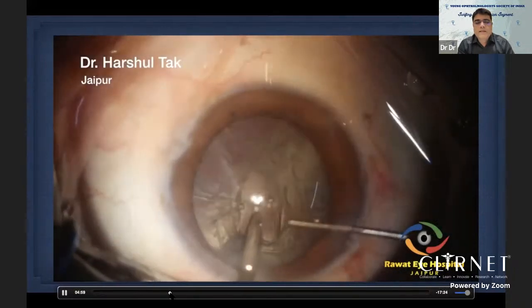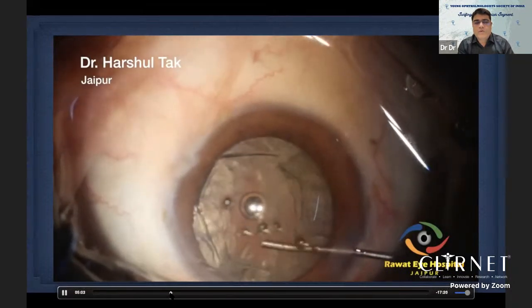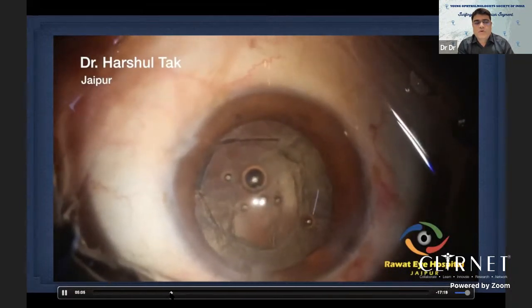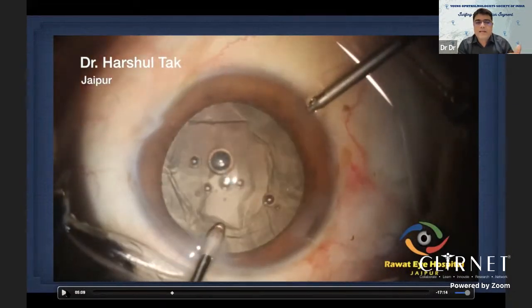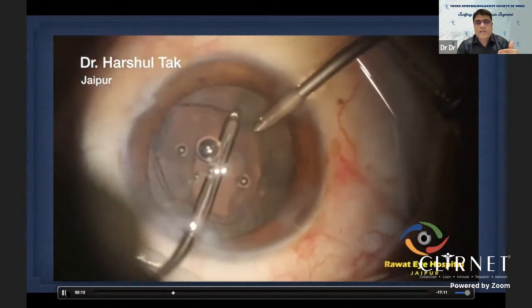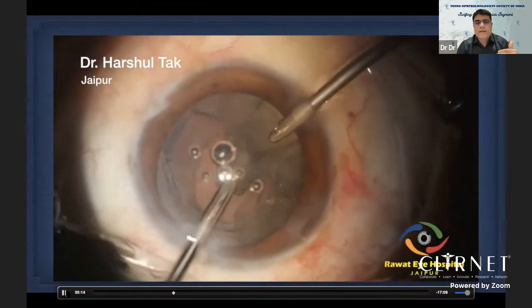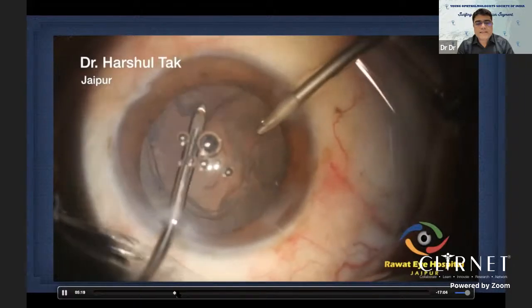Yes. So never let your anterior chamber collapse. Again, I'm putting this chondroitin sulfate based OVD, this viscoat, before you withdraw the irrigation handpiece and before you change your hands. So now, once I've done the adequate anterior vitrectomy, now I can strip off the cortical matter nicely.